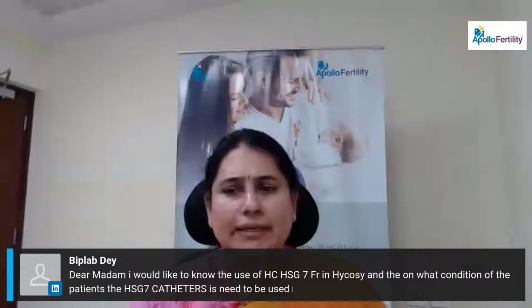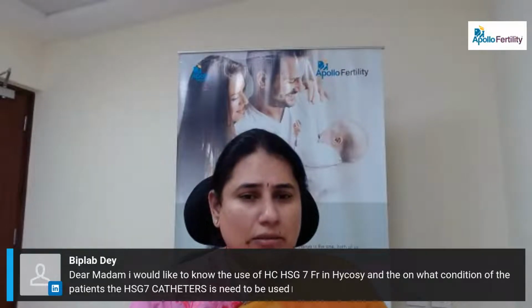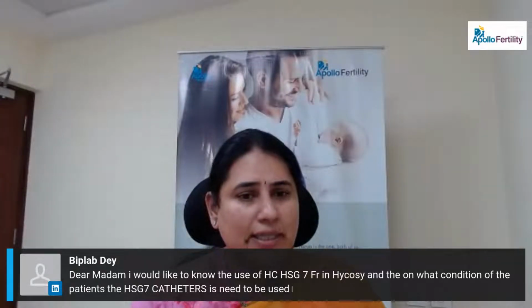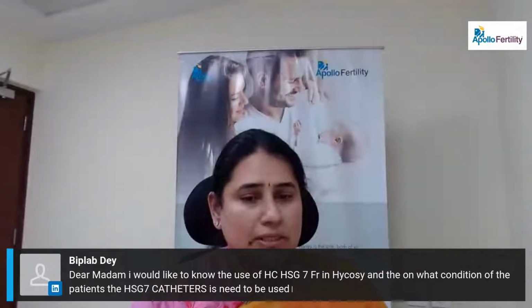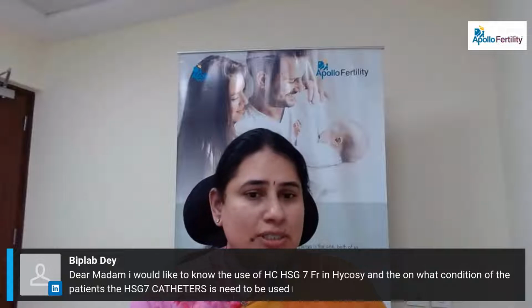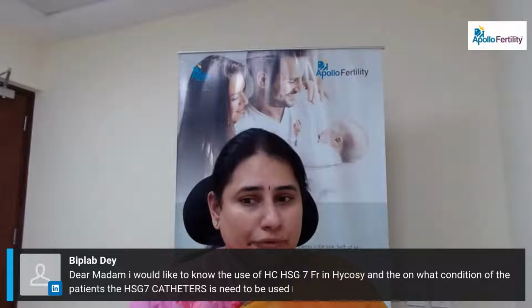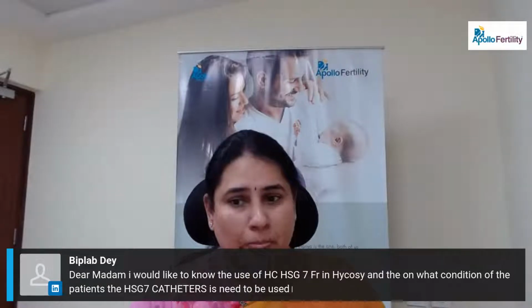Generally the HSG or the tubal test is done between day 6 to day 10 of the cycle. It is done under X-ray, and there are different sizes of catheters depending upon the cervix size. Where there is a small cervix and the opening is small, we have smaller size catheters for injecting the dye, and depending upon the size of the cervix we use the catheter which has to be used.